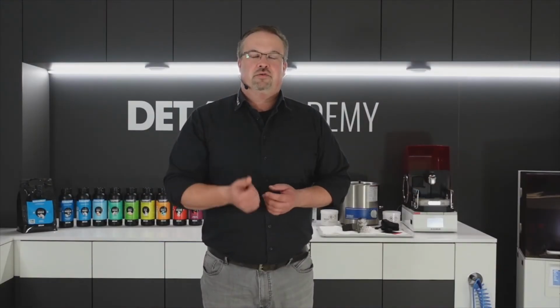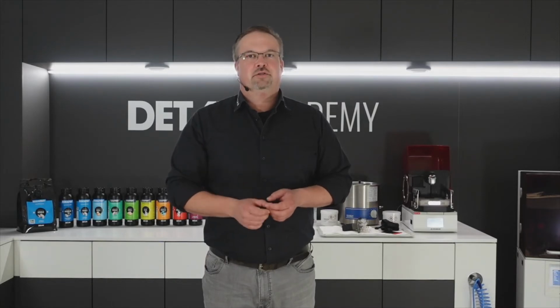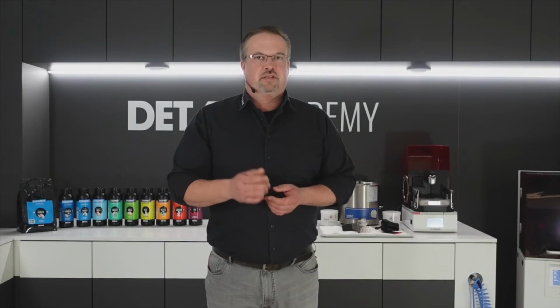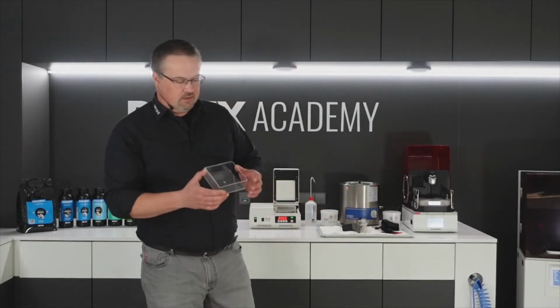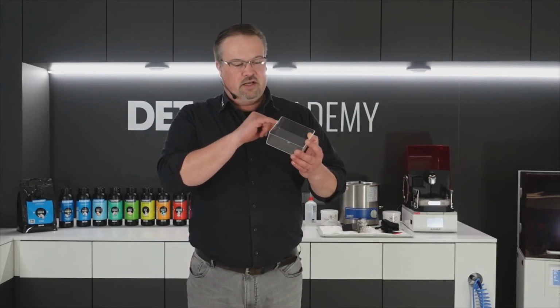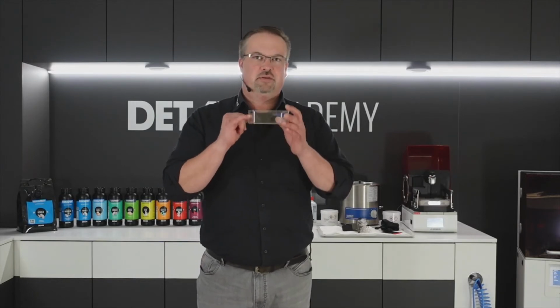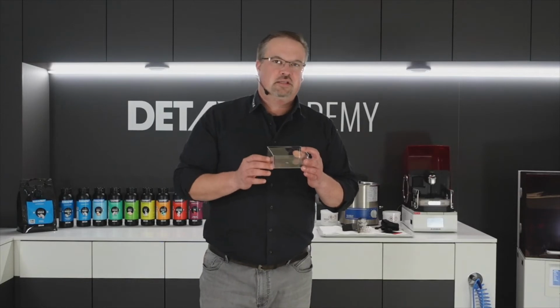Also, if you don't use nitrogen inside of the chamber during the curing process, it will be also sticky on the surface. The plastic box is marked on the corner here. It is NK Optic 360 N2. This is the plastic box you need. There are two differences. 360 is the right one.